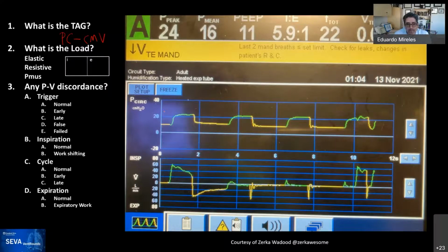This is a good one because you actually have a couple. In this one, you see evidence of PMUS, and we know that's PMUS because it doesn't decay nicely, right? So all of this is PMUS. And in the last one, you again see the same thing. Actually, this is a nice breath to discuss a little bit afterwards, but that's all PMUS. So PMUS on the first one. And what about these ones over here?